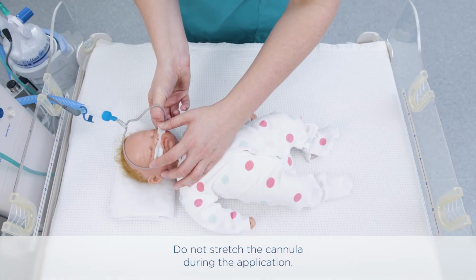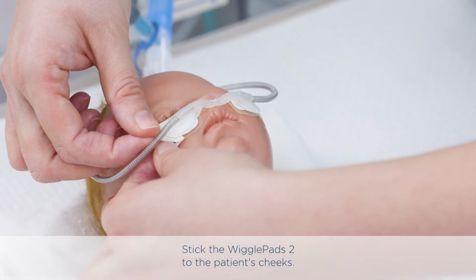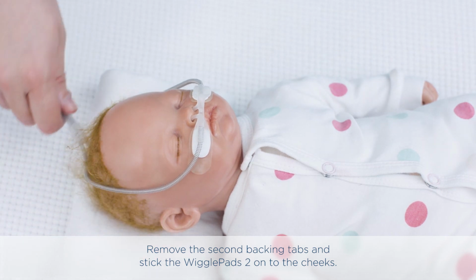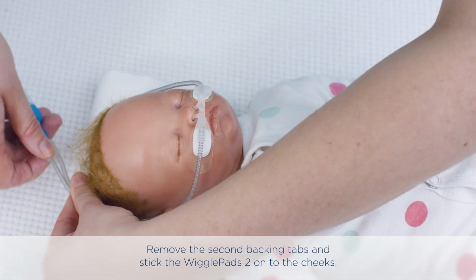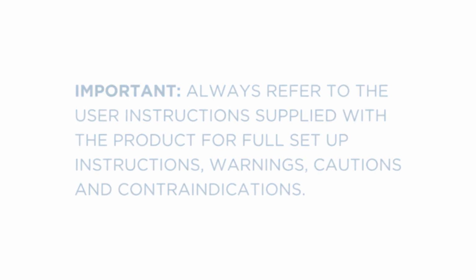Do not stretch the cannula during the application. Stick the wiggle pads 2 to the patient's cheeks. Remove the second backing tabs and stick the wiggle pads 2 onto the cheeks. Important: always refer to the user instructions supplied with the product for full setup instructions, warnings, cautions, and contraindications.